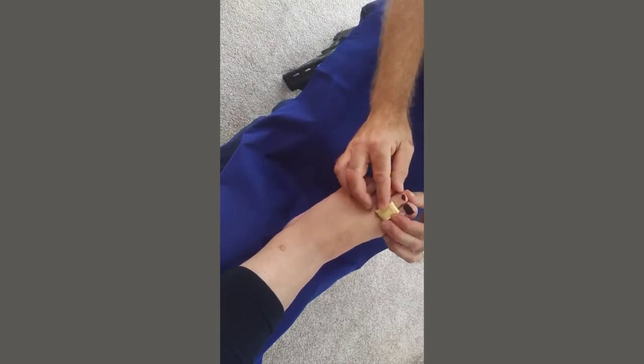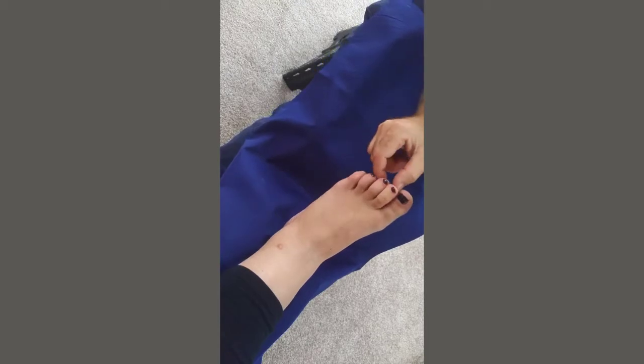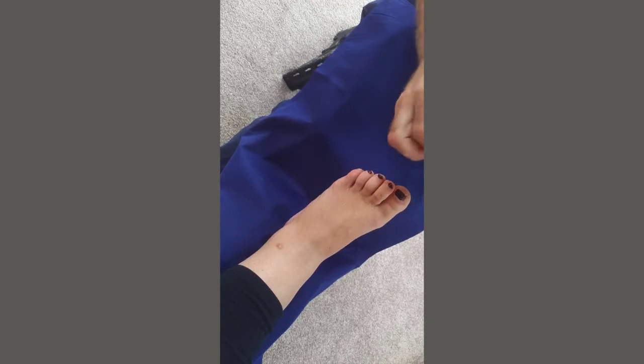So that's our foam toe prop. The two-toe version would be suitable for two toes, and the three-toe version would be suitable for three toes — nice and easy to use to give protection to the toes.